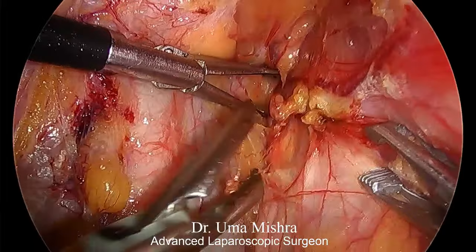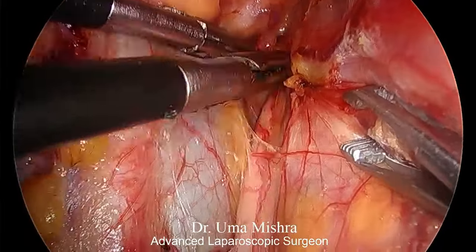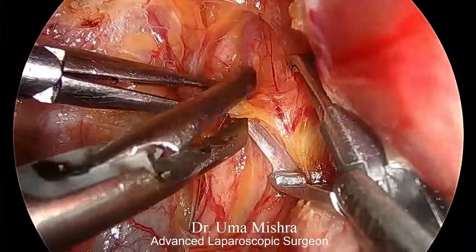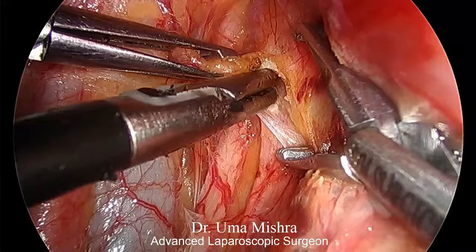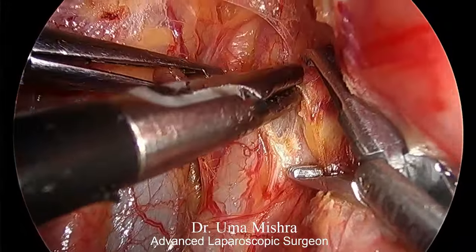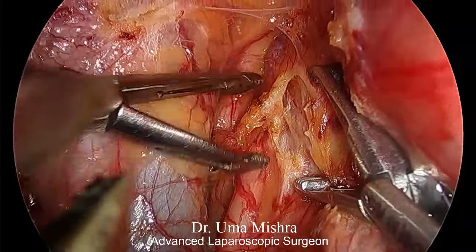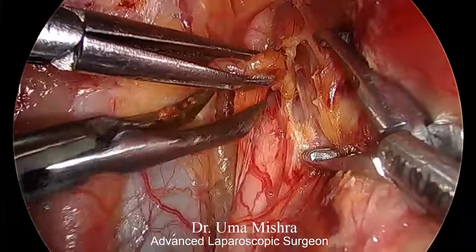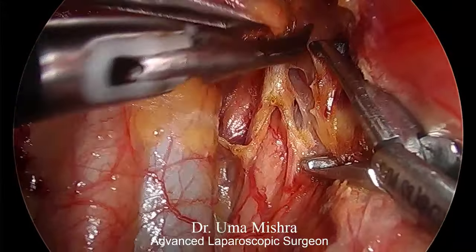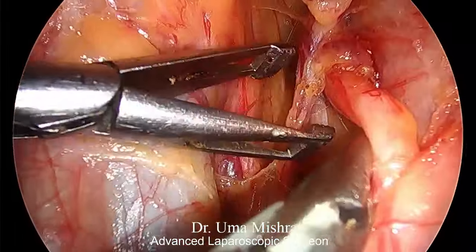So at this point I have visualized ureter. My next target is uterine at origin, because the effect of vasopressin usually lasts for 20 minutes only. So by coagulating uterines at origin we will get a bloodless field for longer time. So at this point it is a little difficult to visualize internal iliac artery.